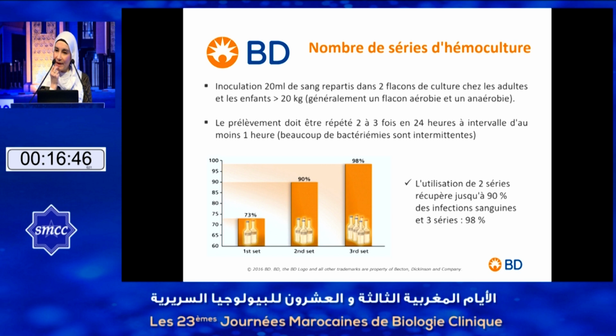Pour le nombre de séries, il est préconisé de faire plusieurs ensembles de flacons d'hémoculture dans les 24 heures. Pourquoi ? C'est pour avoir une cohérence entre les résultats qu'on aura durant la journée. Et le plus important, c'est de faire une prise de sang de 20 ml sur deux flacons différents, un flacon aérobie et un autre flacon anaérobie.